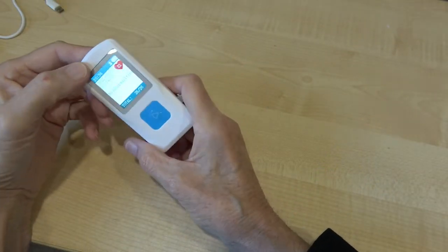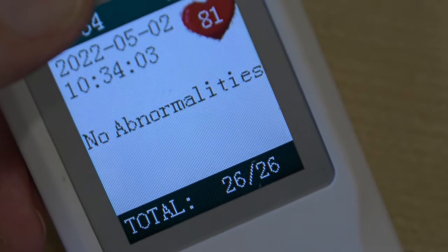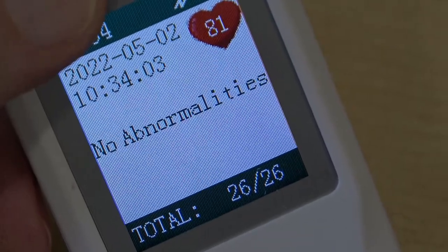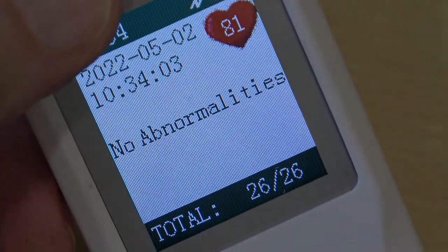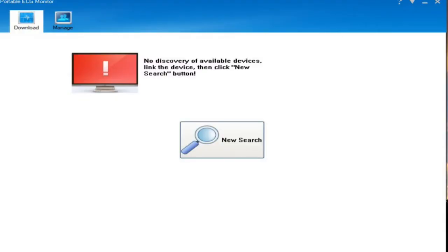This is actually an amazing result because it says 'no abnormalities,' and I must admit for me that is remarkable because I have fibrillation issues and all sorts of problems, which I'll show you in a minute on the software. When you click on the heart icon in the software, it's clearly waiting for you to do something.